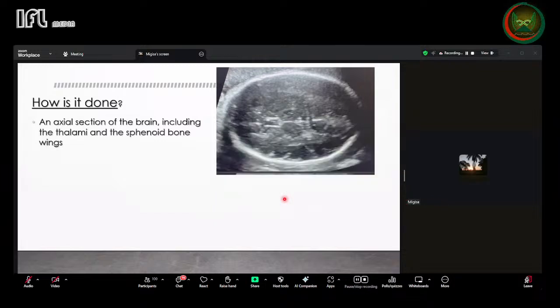The cut is here, we have the cavum septum pellucidum, we have the thalami, we have the falx. You want to make sure your sides are all symmetrical and your head is round properly. Usually preferred oval.